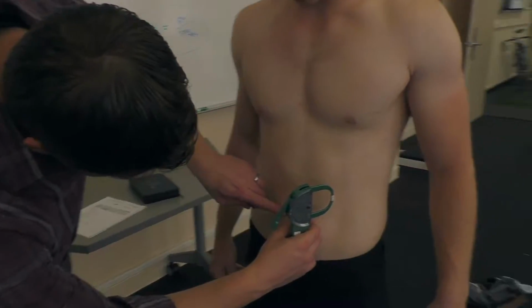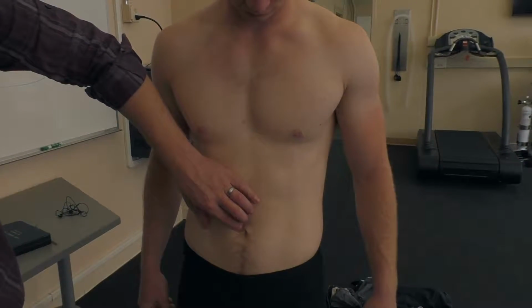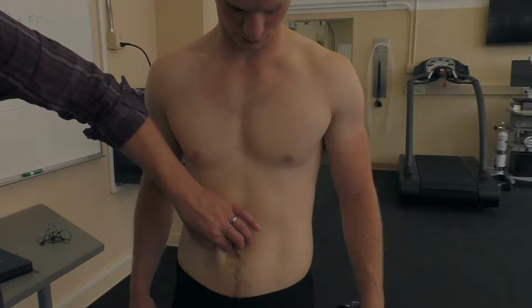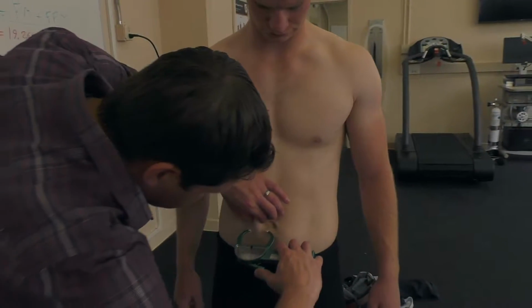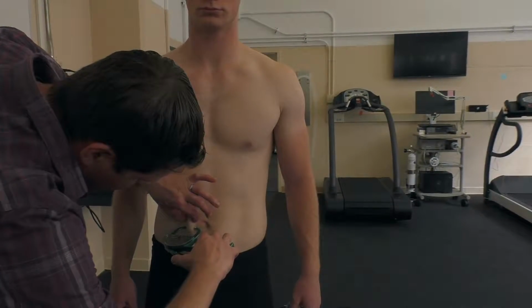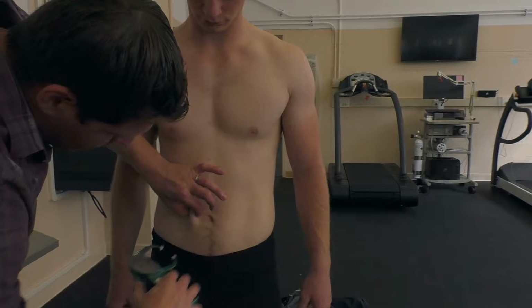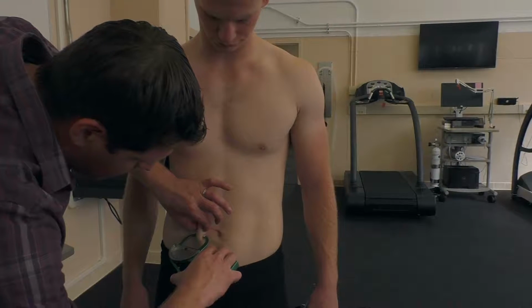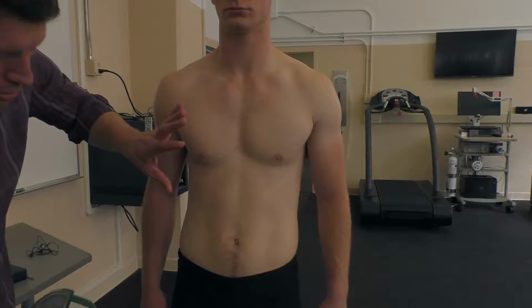So you measure it with our little measuring tape here, and once you have that, you can kind of indicate it with your finger. And when you go down to take your skin fold, you want to reach as far down as you can until you hit muscle. So you want to take as much of the subcutaneous fat and skin as you can. When you bring the calipers in, as you can see here, you want the calipers to not be touching your fingers. You want to have about 1 centimeter in between each, okay? So as not to essentially push the fluids and some of the subcutaneous fat out of the pinch. When you reach in then, you will place the caliper about halfway in between the base and the crest of the fold. For example, this was 11. You release the caliper, then you release the pinch.